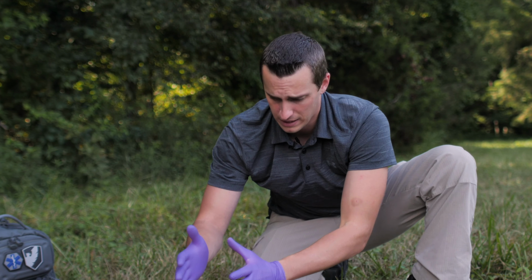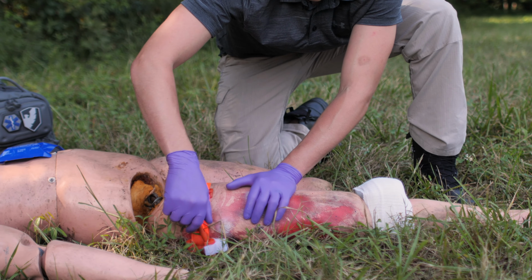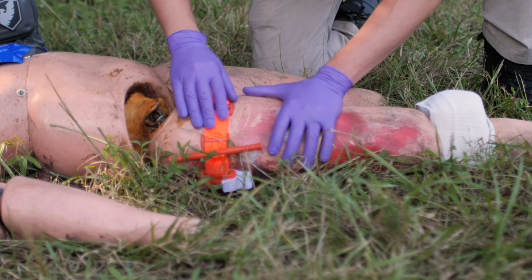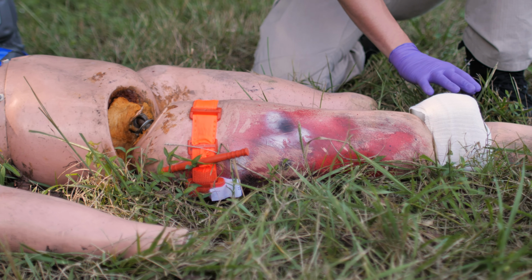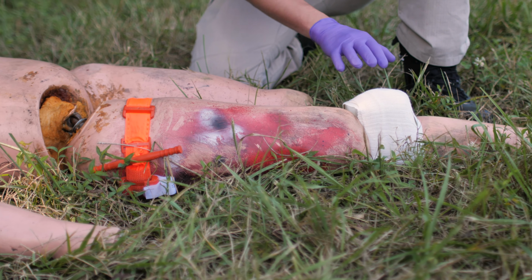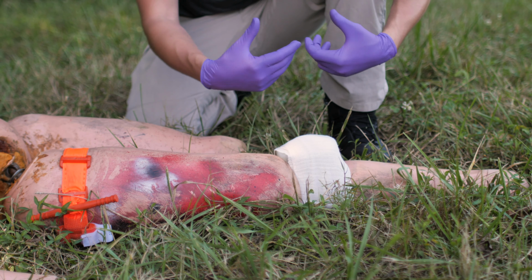So we don't have any bleeding at this point because the tourniquet's still in place. So I'm gonna take this, we're gonna go ahead and loosen this up. And I'm gonna loosen this for a second. We've got some pressure off of this tourniquet, but now I'm gonna monitor right here and make sure that we don't have any blood start seeping through. So as I'm monitoring, I'm making sure that this doesn't start filling up with blood.